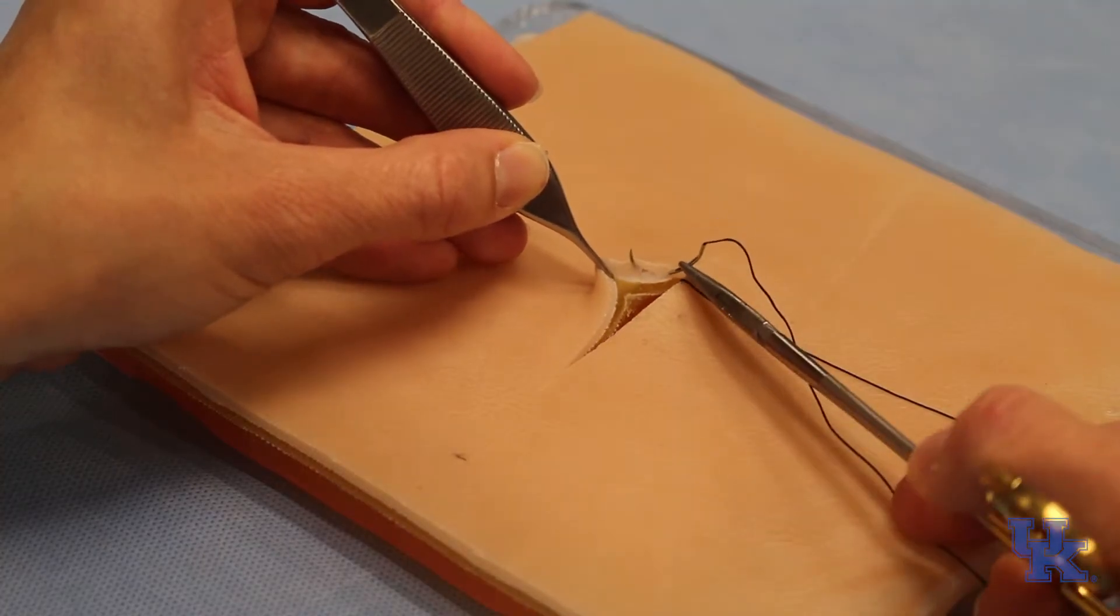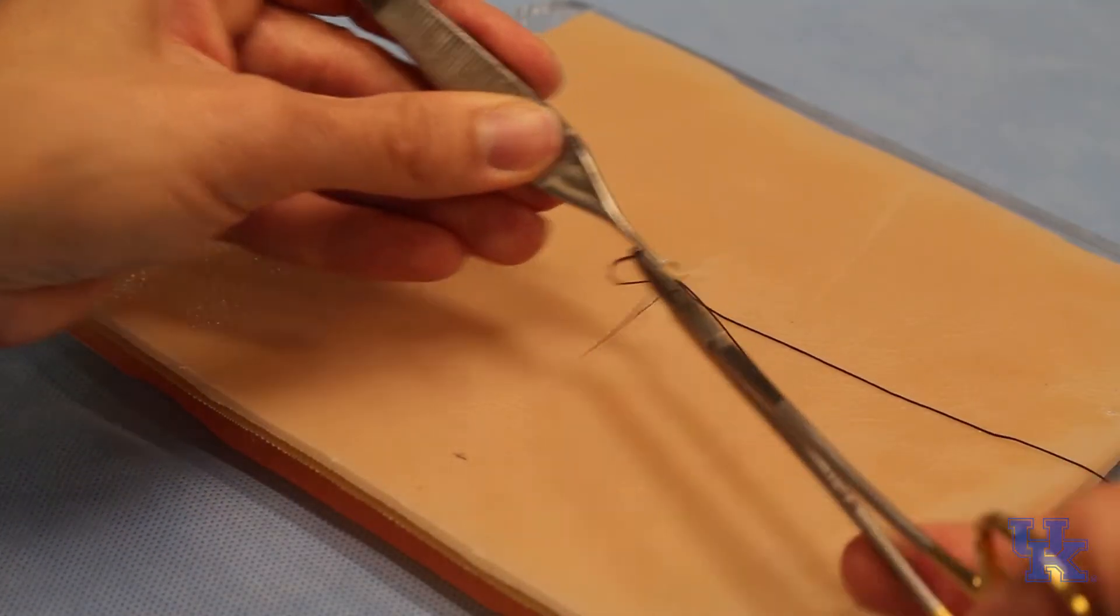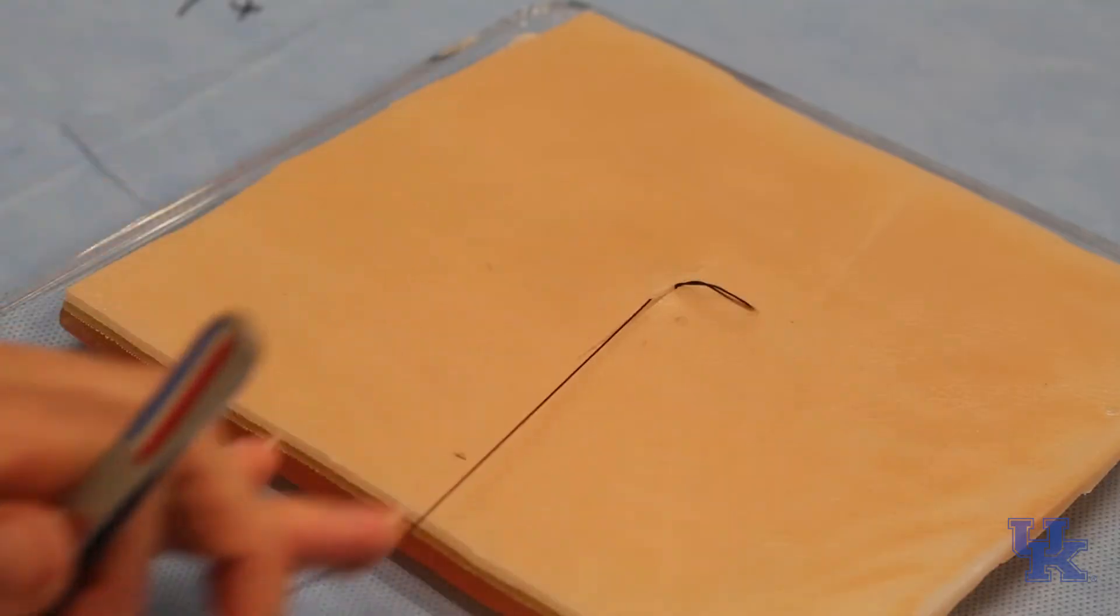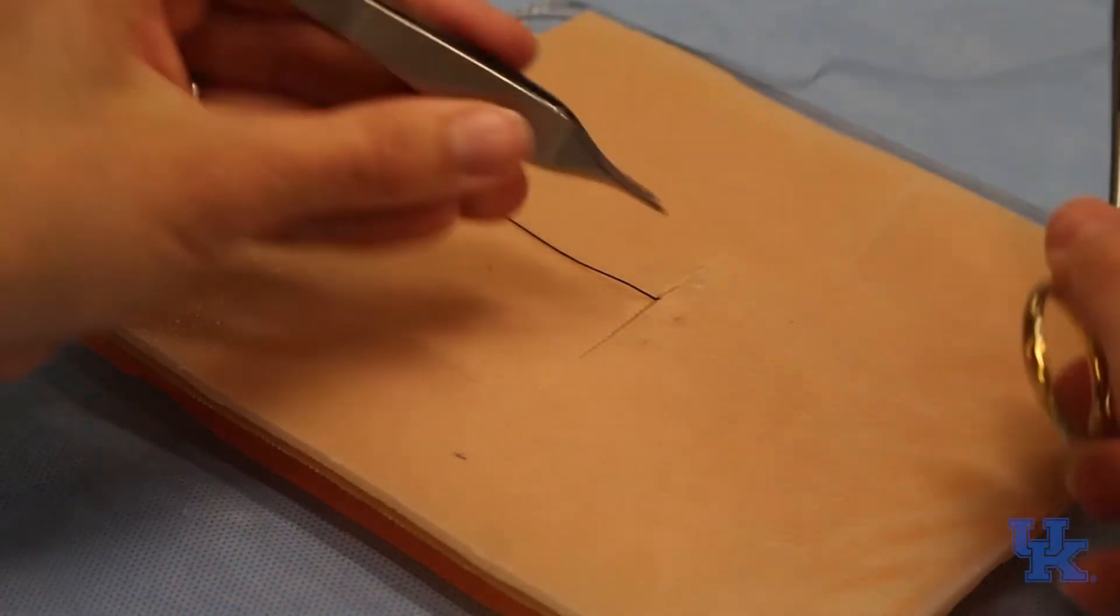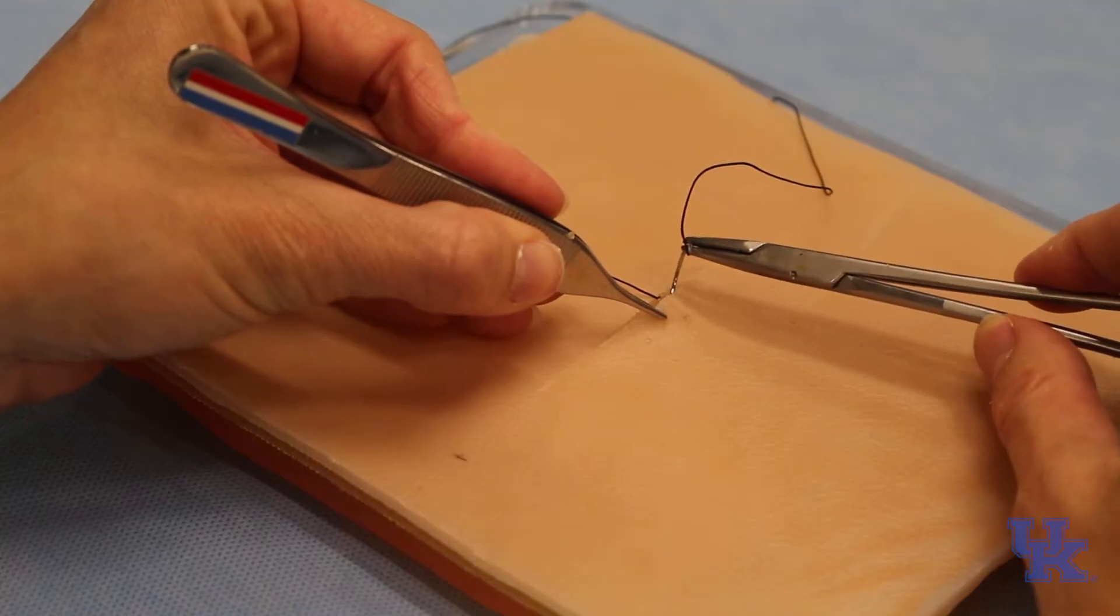Rotate, come back out just below the skin edge. Hold this up, go in at the skin edge.